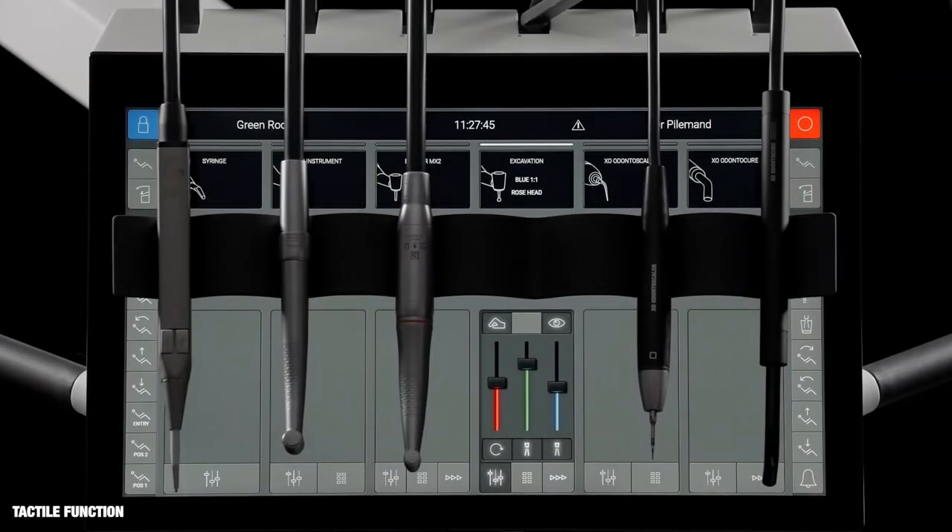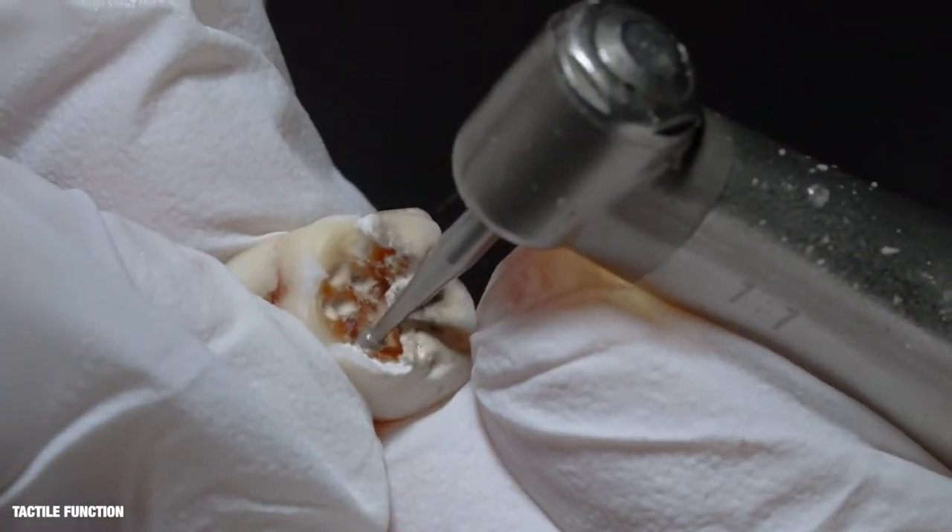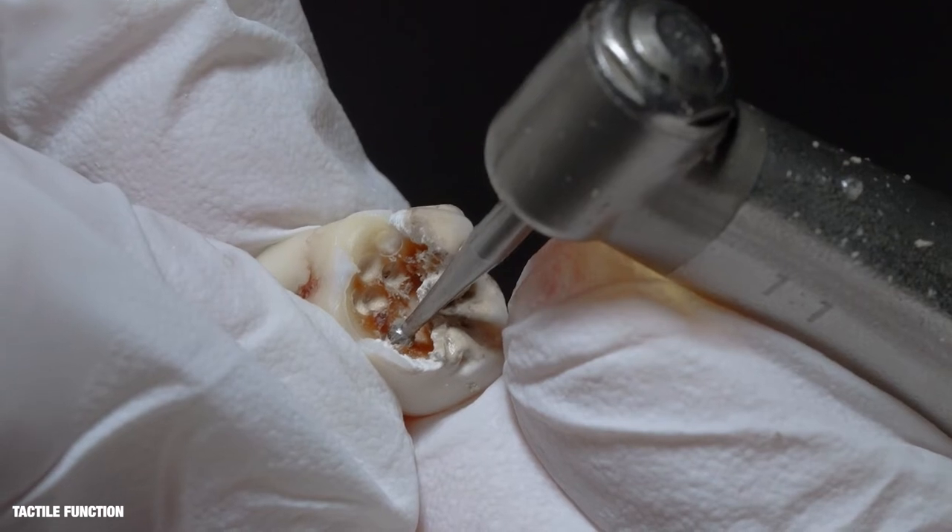In the excavation preset, the tactile function is enabled. The burr will stop rotating when touching healthy dentine.